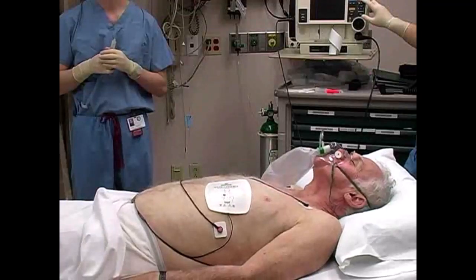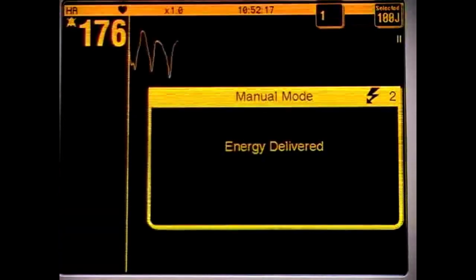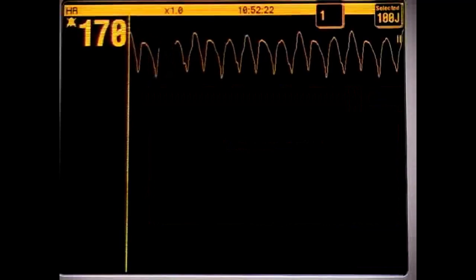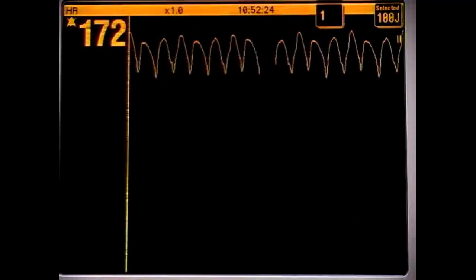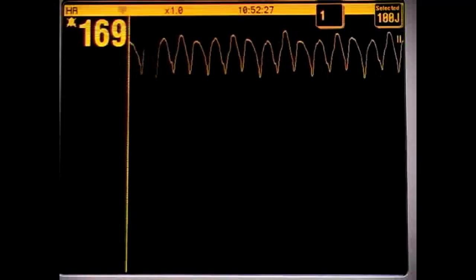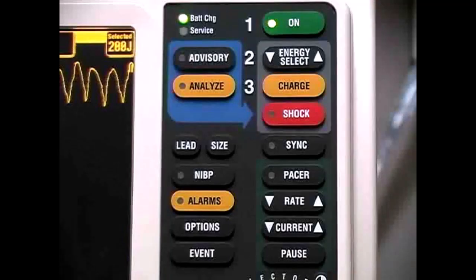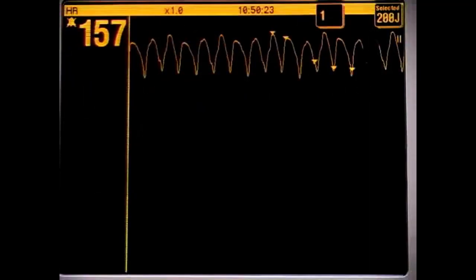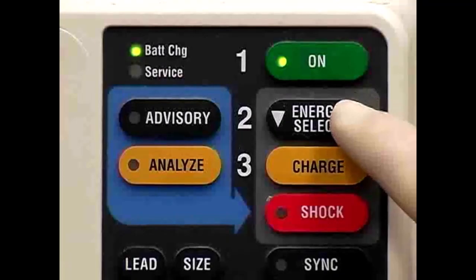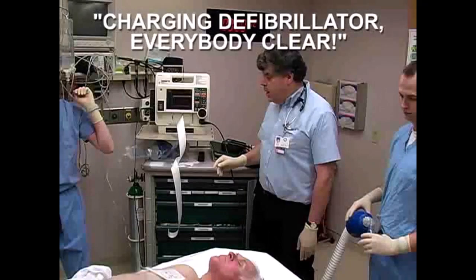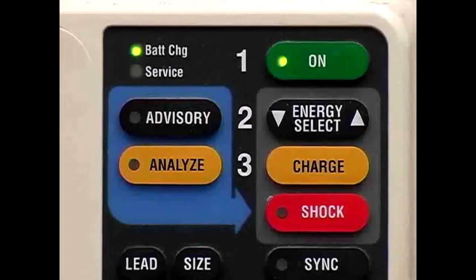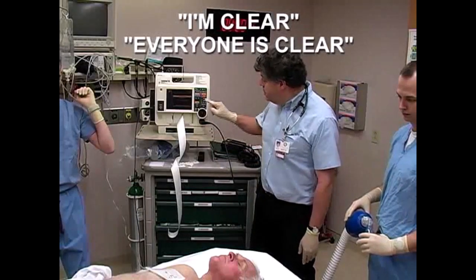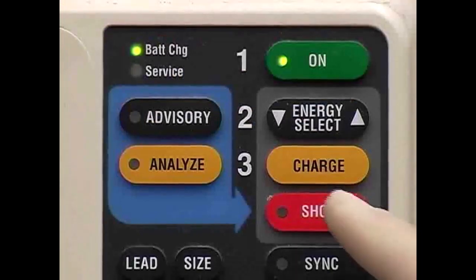After the machine discharges, check the resultant rhythm. If the tachydysrhythmia persists, prepare to cardiovert again, this time at a higher energy. Repeat the same sequence as used in the initial shock: activate the Sync button if desired, confirm proper sensing of the QRS complex, select the appropriate energy level, clear the patient, charge the defibrillator, recheck to make sure that everyone is clear, and finally deliver the countershock.